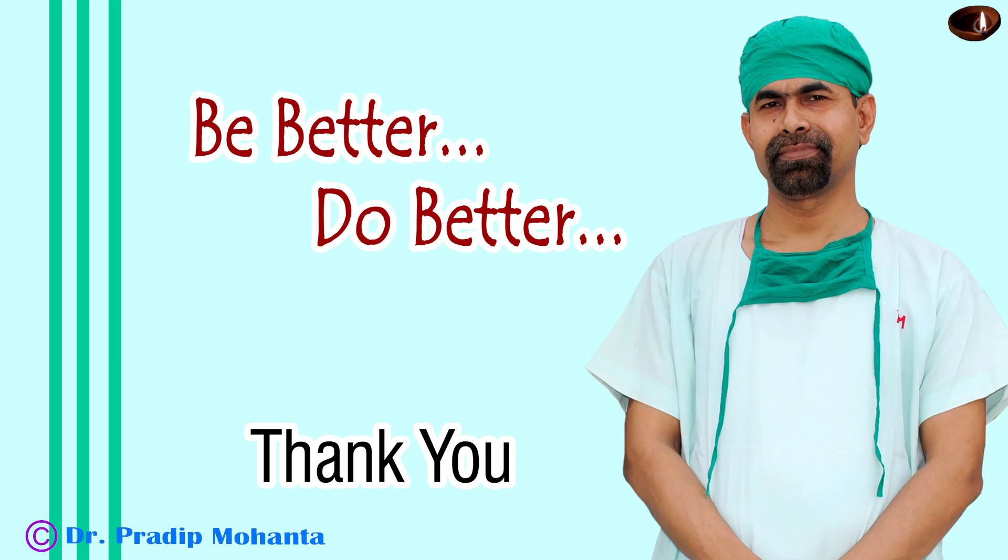Thank you very much for your attention. Hope this video will help you in developing your surgical skills. The pre-chopper is a nice tool. I find it very useful for soft cataracts. You may try this instrument — I think this is a good tool to try out.